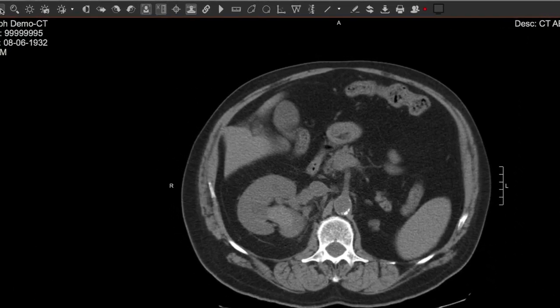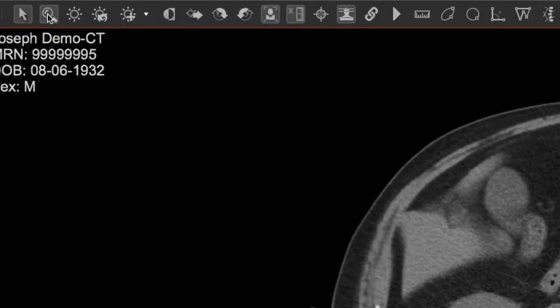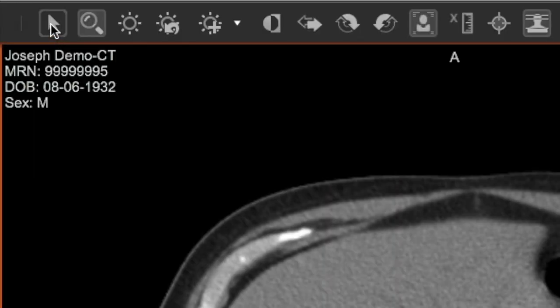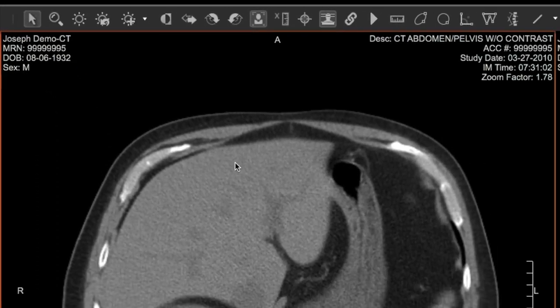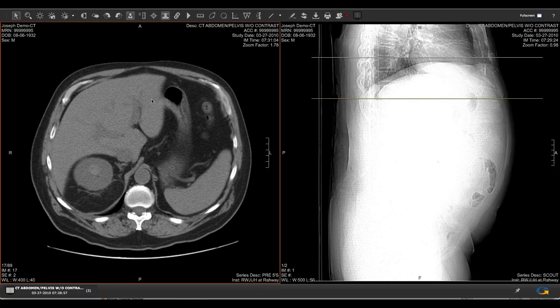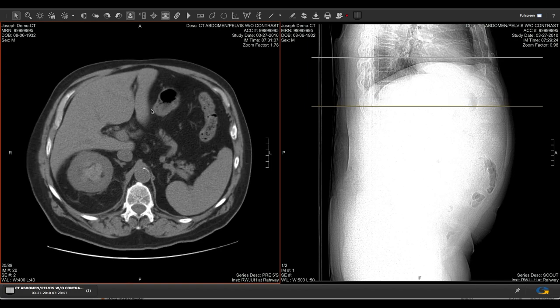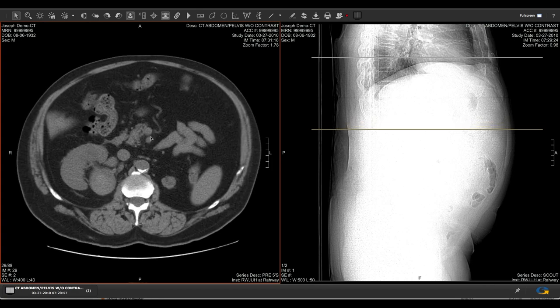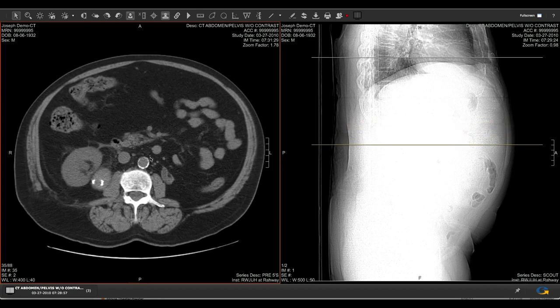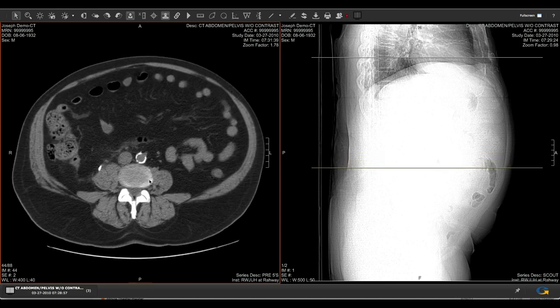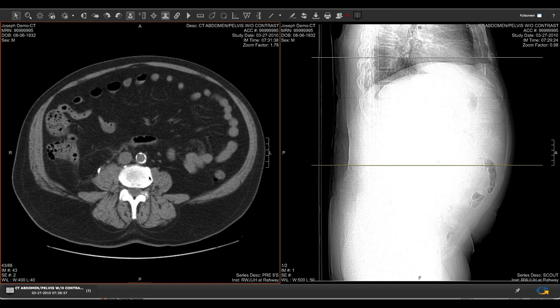The tools you are most likely to use are located along the top left side of the toolbar. Click on the Navigate button and notice how it is highlighted — every button behaves this way when activated. Select one of the series windows, which will typically contain multiple images arranged as slices in a stack formation running through your body. You can scroll through these slices by clicking and holding your left mouse button and dragging up or down, or use your scrolling wheel or up and down arrows on your keypad.